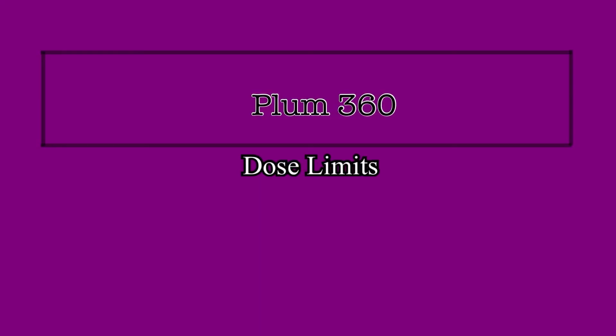That is why the hard limit exists, and also why it is important to always use the drug library when programming a medication infusion. It is there to help make medication programming easier for the nurse and to ensure the safety of our patients.